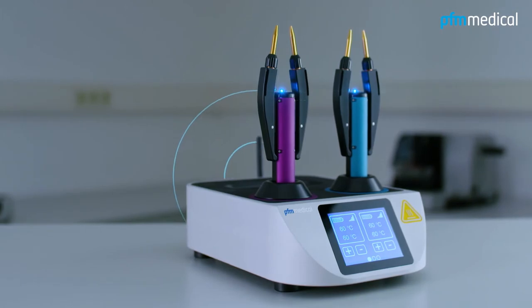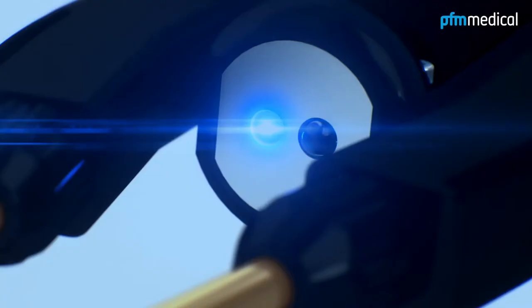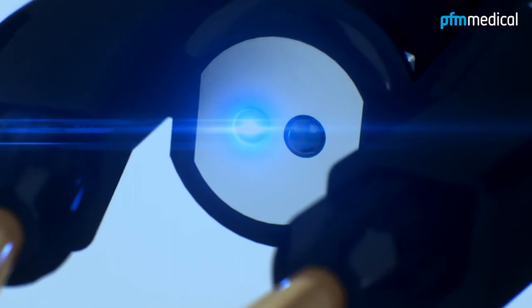The PFM Forceps EWF600 is controlled via a Bluetooth signal. The blue diode on the forceps indicates a stable connection.